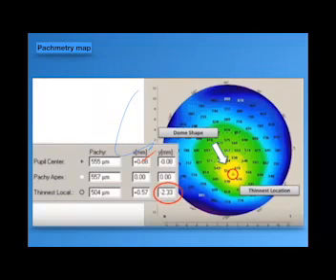And also the deviation here, which is marked by the red oval, the Y coordinate is more than -1. It's -2.3, vertical inferior, more than -1. And the difference of thickness between the apex and thinnest location is more than 10 micron.